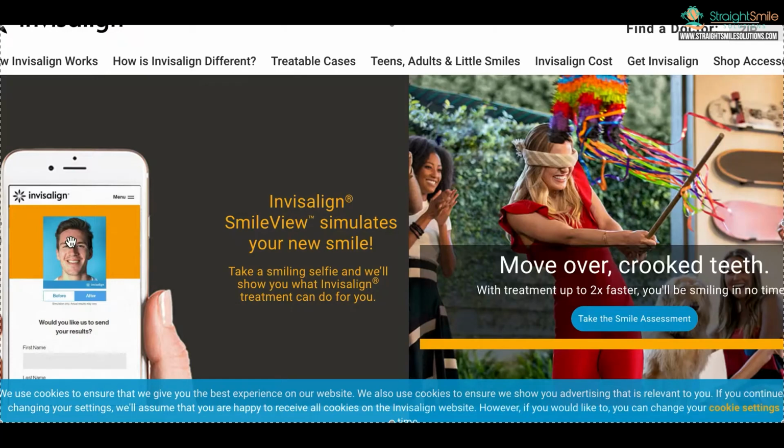Once I took this webinar, I was not impressed at all. Technologically, I thought it was cool, but no. But anyways, I'm just telling you my opinion. You can choose to do whatever you want. I'm sure I'm going to get all kinds of nasty messages, but I didn't realize that was the way it was going to work, and I was quite disappointed, actually. But in any case, it's there.